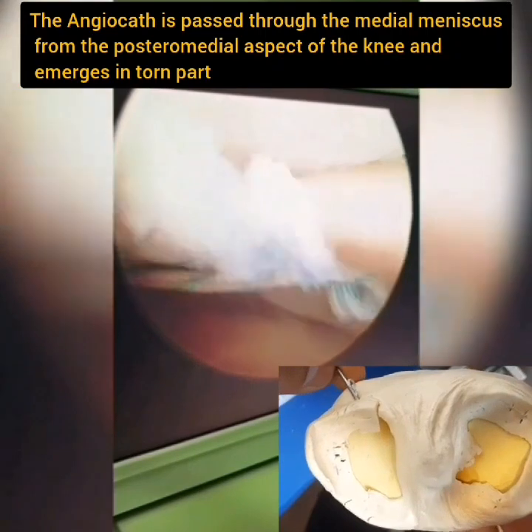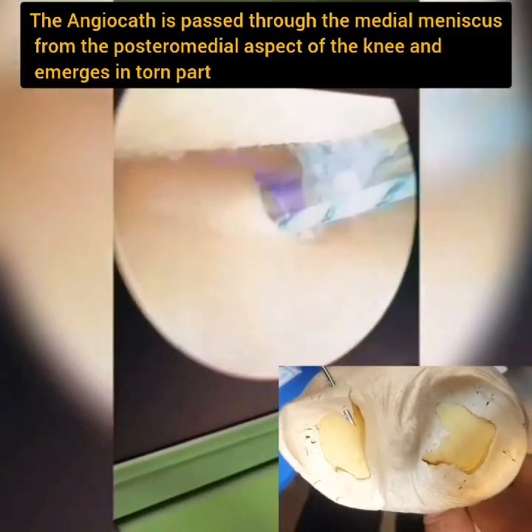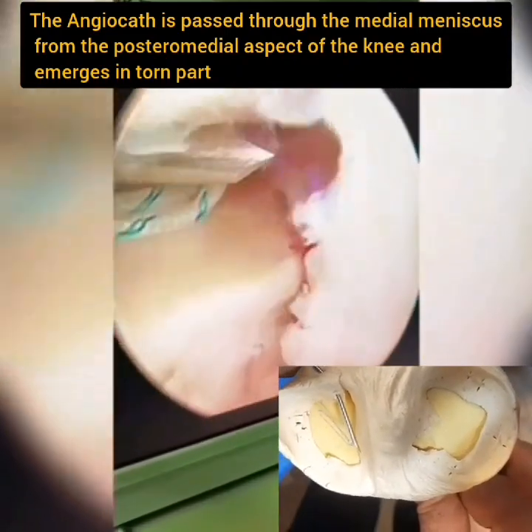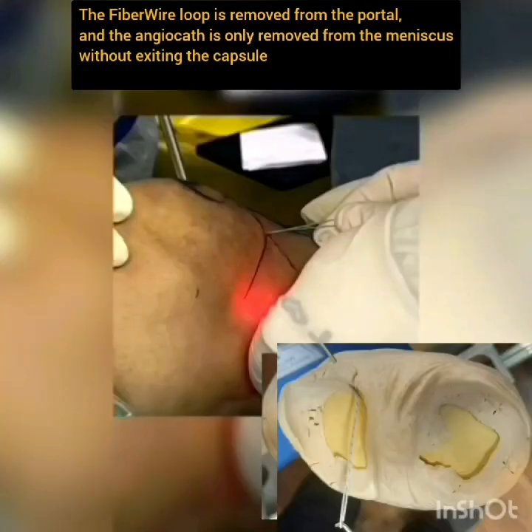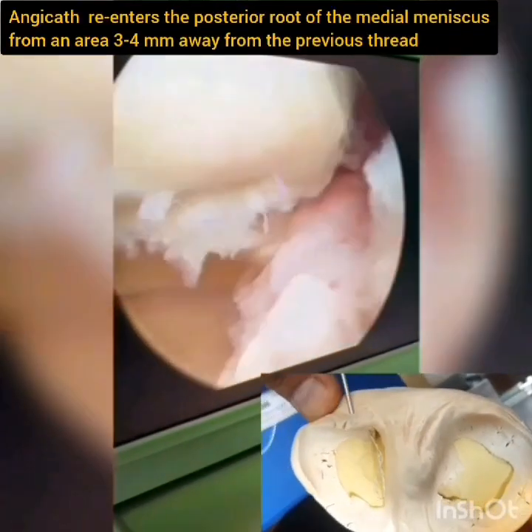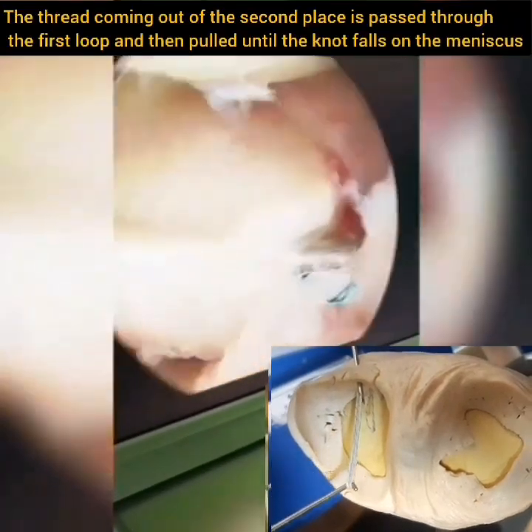The angiocath is passed through the medial meniscus from the posteromedial aspect of the knee and emerges in the torn part. The fiber wire loop is removed from the portal, and the angiocath is only removed from the meniscus without exiting the capsule, then re-enters the posterior root of the medial meniscus from an area 3 to 4 mm away from the previous thread.